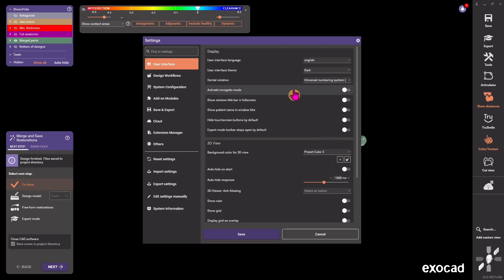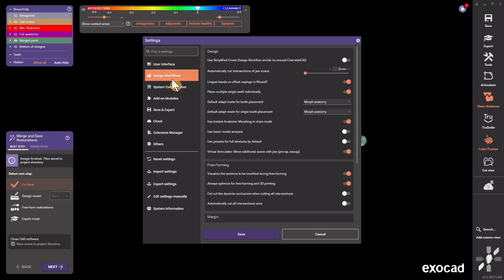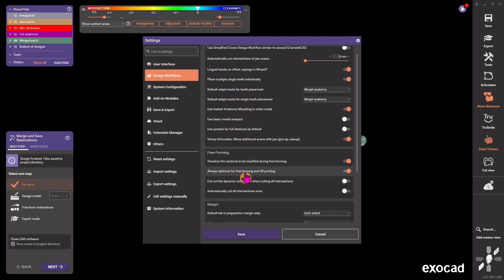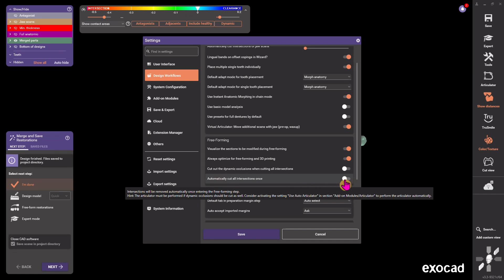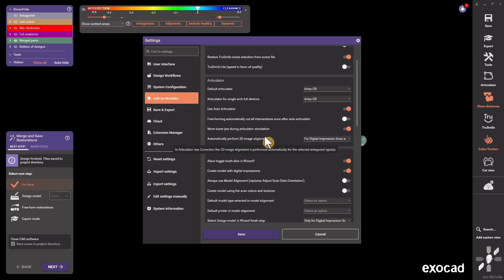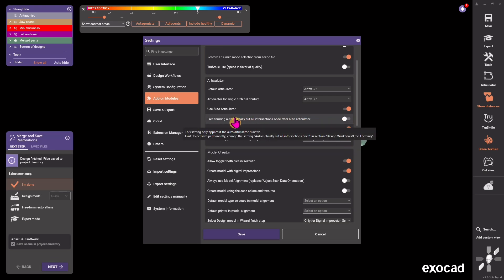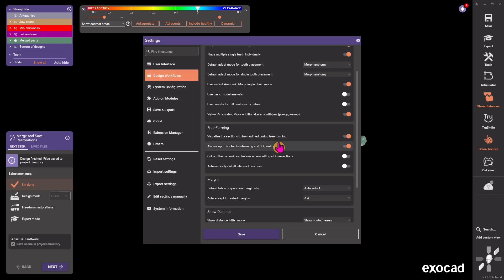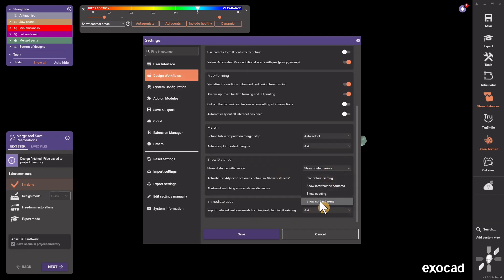In Tool Settings, some of you have the setting where entering Freeform automatically cuts all intersections, and that's causing problems — giving you little mushroom shapes. Make sure that's turned off: it's the 'Automatically Cut Intersections' setting. It also shows up in Add-On Modules, so go there and turn it off as well so it won't automatically cut all intersections when entering Freeform. Also make sure Show Contact Areas is on instead of Show Interference Contacts. This should all be set up by whoever you purchased exocad from — lean on your distributors more to help you out.